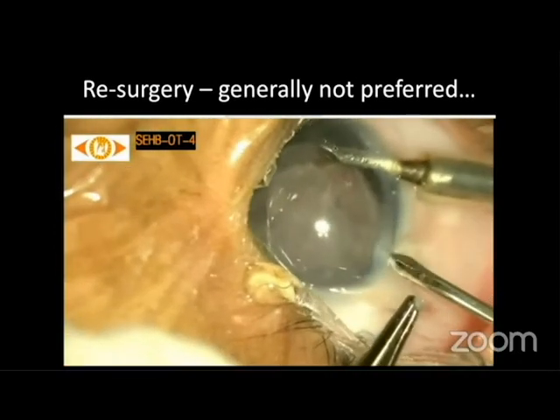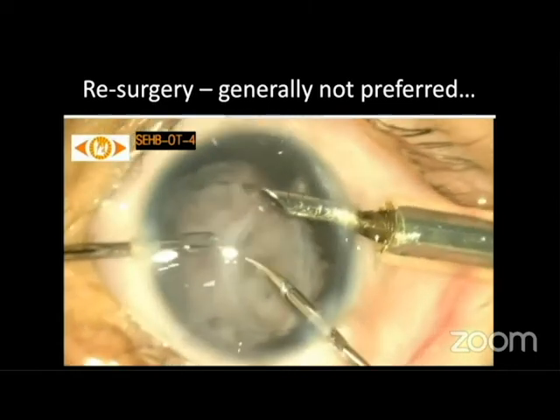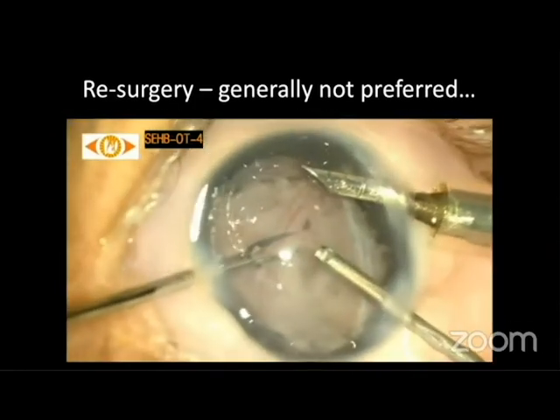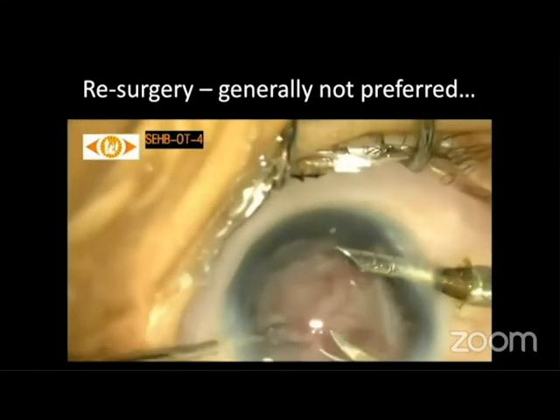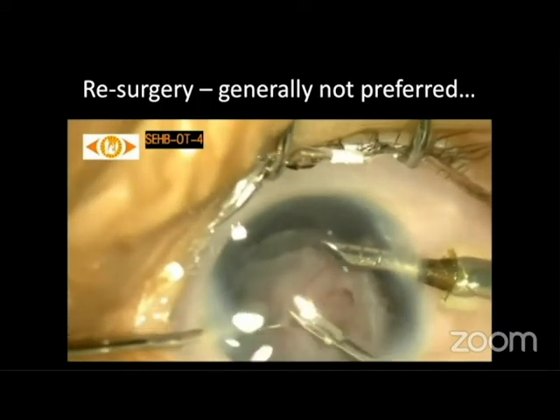And this is one such case where the retina did not go back, but developed a lot of pre-retinal proliferation. As you can see, the anterior chamber maintainer is placed, and because we have removed the iris in the previous surgery, the entry into the eye is through the limbus itself, and a sharp dissection again. All the reproliferated tissue is removed.